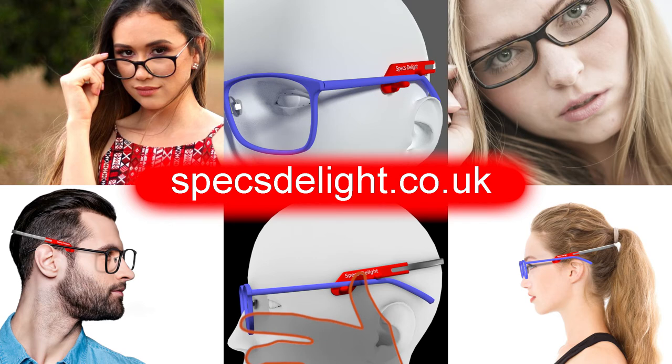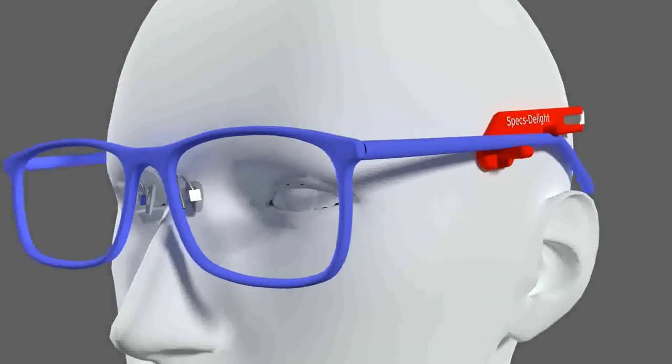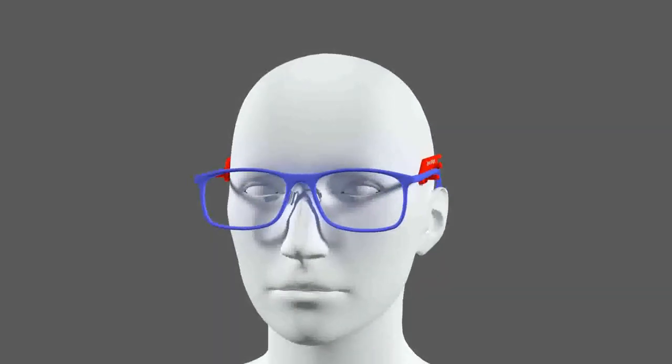When you get your new Spexty Light, you will need to know how to correctly fit it. To help you with this, here is a video that explains in detail how to get the best from your new Spexty Light. The Spexty Light should allow you to wear glasses after rhinoplasty with a little style.